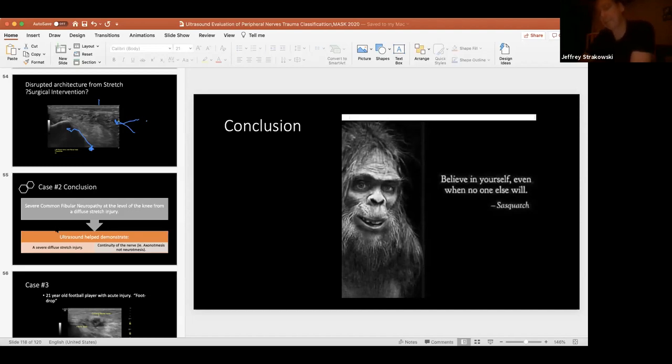If I take a simpler example like the ulnar nerve, it's pretty easy to scan the entire thing, even all the way up to the plexus, and there's actually not a great reason not to. It doesn't mean you have to do calculations at every level, but when you're short of access to something, you can move right along. That's the beauty of ultrasound over MRI: you don't have any separate cuts, and you can see the entire thing continuously in one continuous loop.